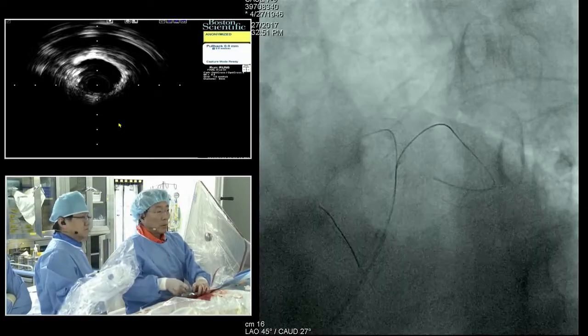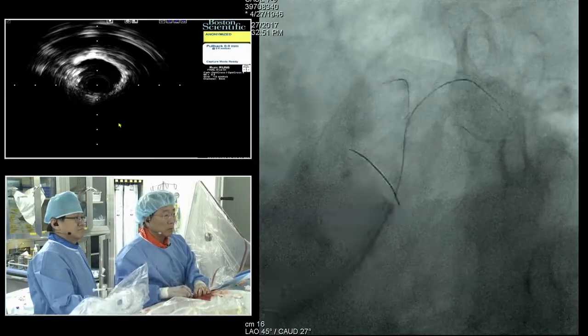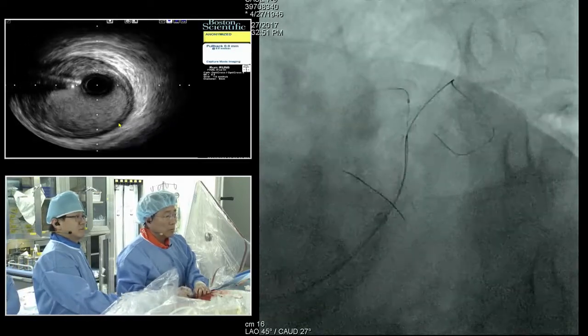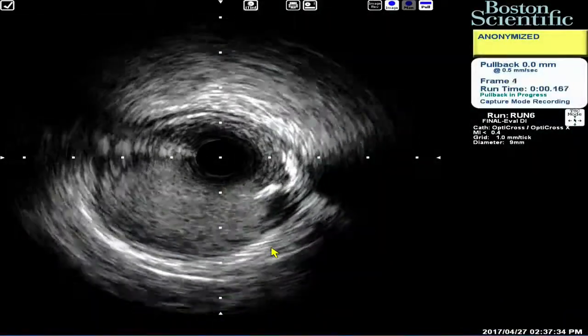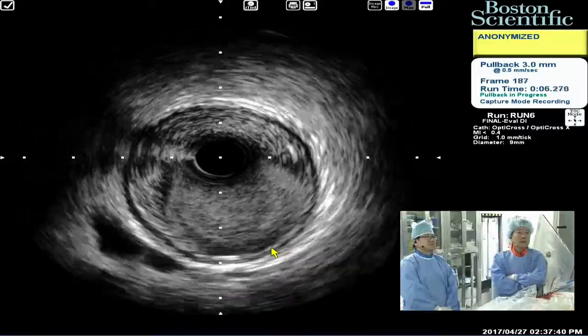Dr. Park will give us some data about the recent temporal trend changes in bifurcation interventions. Oh, this is the LAD. LAD first. You mentioned LAD, right? All right, LAD first. Okay, this is the LAD.